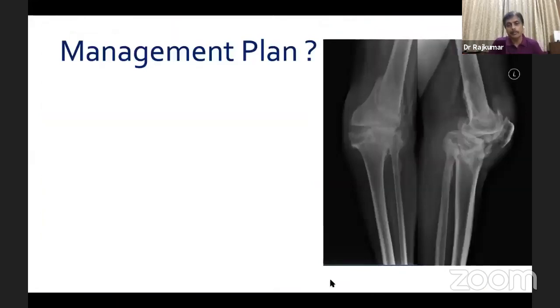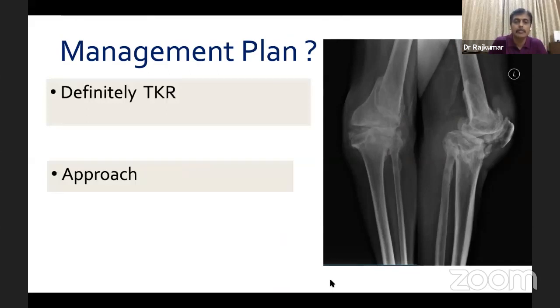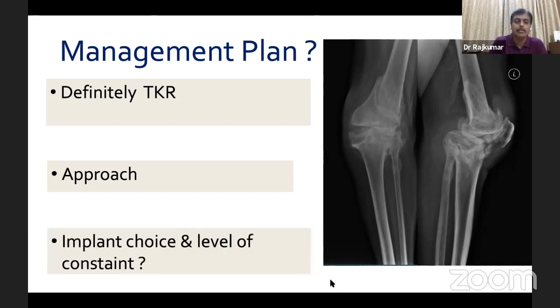So coming to the management plan here, in this case, definitely needs a total knee replacement. But the approaches, there were two schools of thought, whether to do a lateral approach or a medial parapatellar approach, like as we discussed earlier. In this case, I did a medial parapatellar approach. The question is the implant choice and the level of constraint.